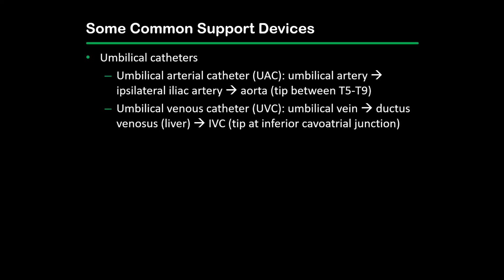Some common support devices you would see more in the NICU rather than in the ER setting. You can have umbilical arterial catheters or umbilical venous catheters.